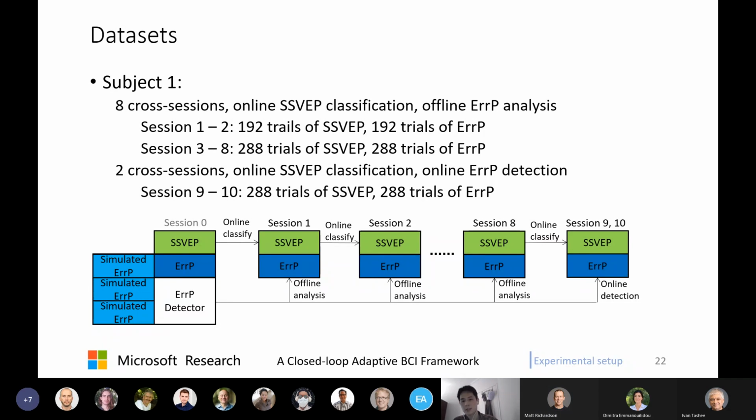It could be a mix. Even if the potential is induced by the visual effect, the system could still work, because you can always have this kind of visual feedback stimulation to the user.